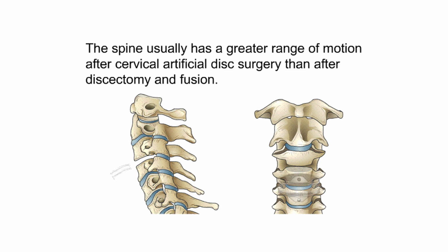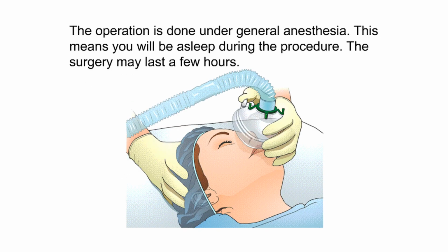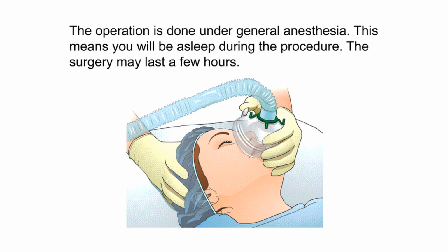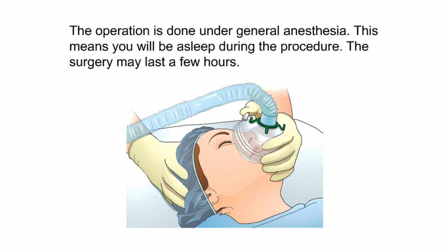The spine usually has a greater range of motion after cervical artificial disc surgery than after discectomy and fusion. The operation is done under general anesthesia. This means you will be asleep during the procedure. The surgery may last a few hours.